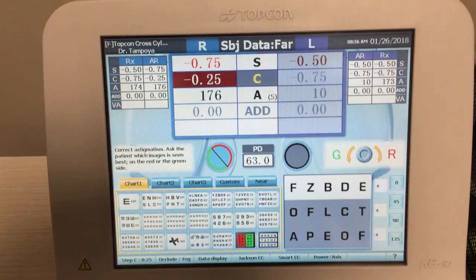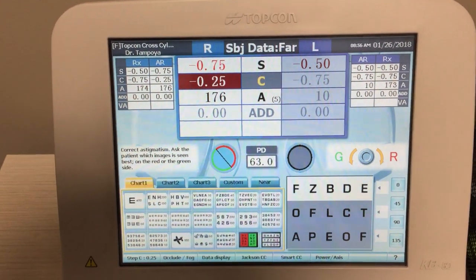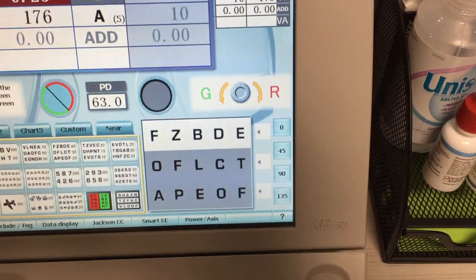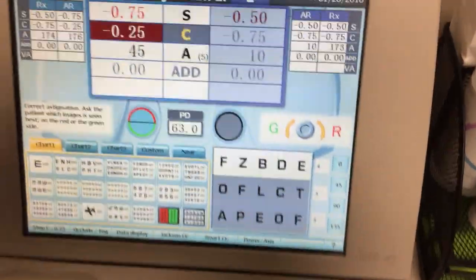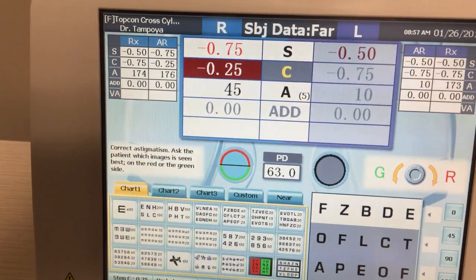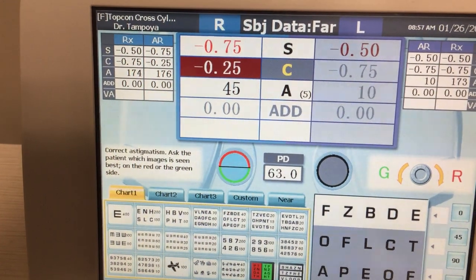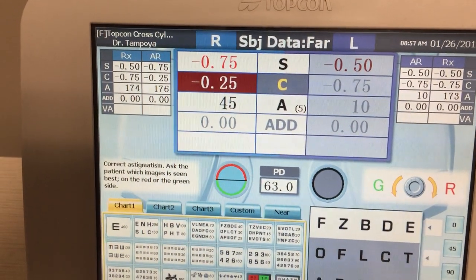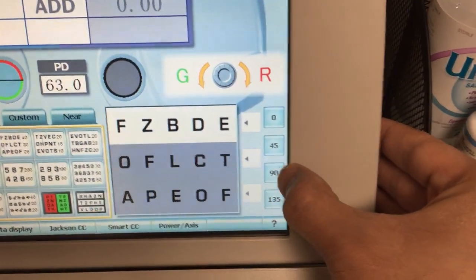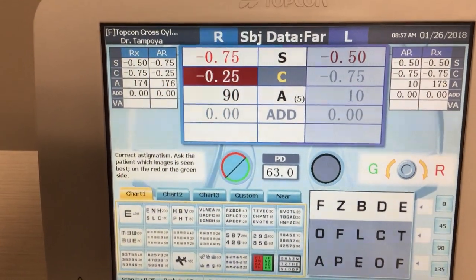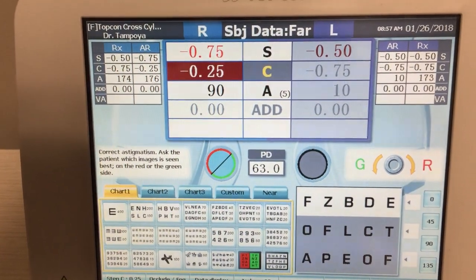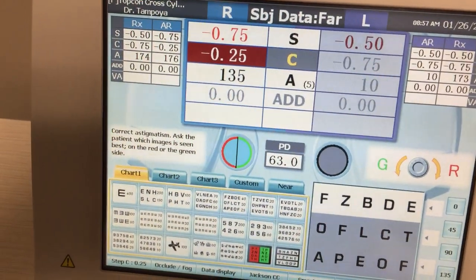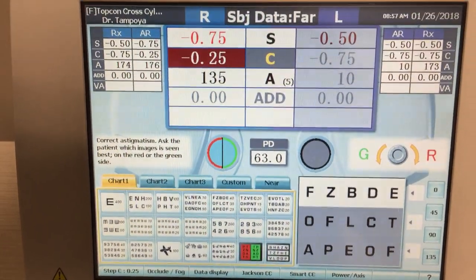While screening for cylinder on the 176 degree axis, let's say the patient says the green side is clearer — that's a rejection of the axis. I go to the next major axis, 45 degrees. The screens have rotated so now there's a screen on top with red and one on the bottom with green. Let's say the patient rejects the cylinder at 45 as well, so we try 90 degrees — the letters have rotated — and then 135 degrees. The patient says green on all axes, meaning another rejection each time.